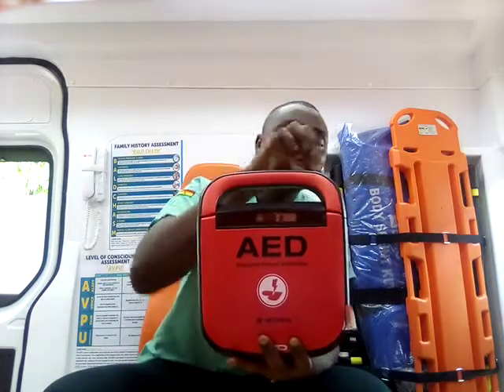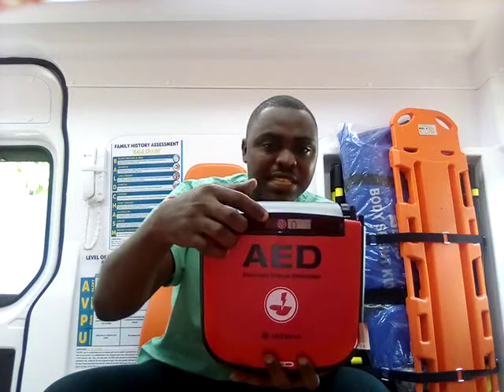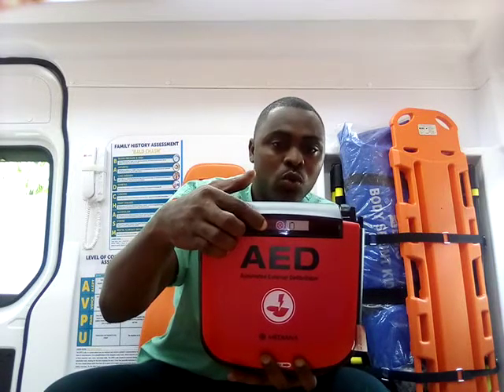Now, let's take the battery off and look at the next indicator. As I took the battery off, you realize that the indicator moved from the blue indicator, which is O, to X, which is red in color. The moment you find this X on this particular AED, it basically tells you the unit is not okay and it's not ready for use. You also realize that the battery level is empty, so it basically tells you that it cannot provide you the shocks and basically it cannot work at all.